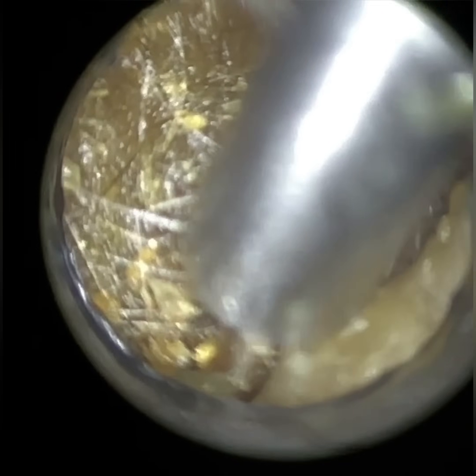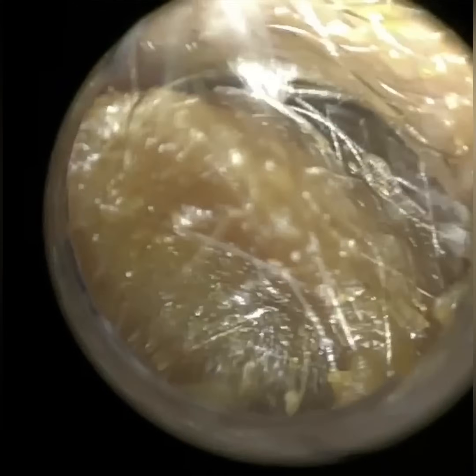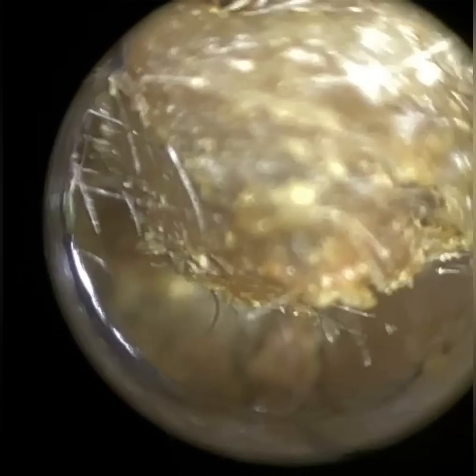I'm just dilating the ear canal. As I said, we have the full size range. For me, I'll probably be using the 4.25mm most often — that's my go-to. For a narrower ear I'll revert to the 3.5mm. The 5mm and 5.75mm are more for larger ear canals — you probably won't see them as often, because most people with earwax do have narrow, twisted ear canals, which is one of the causes. For mastoid cavities, the 5.75mm would be great. But we've got all the options.